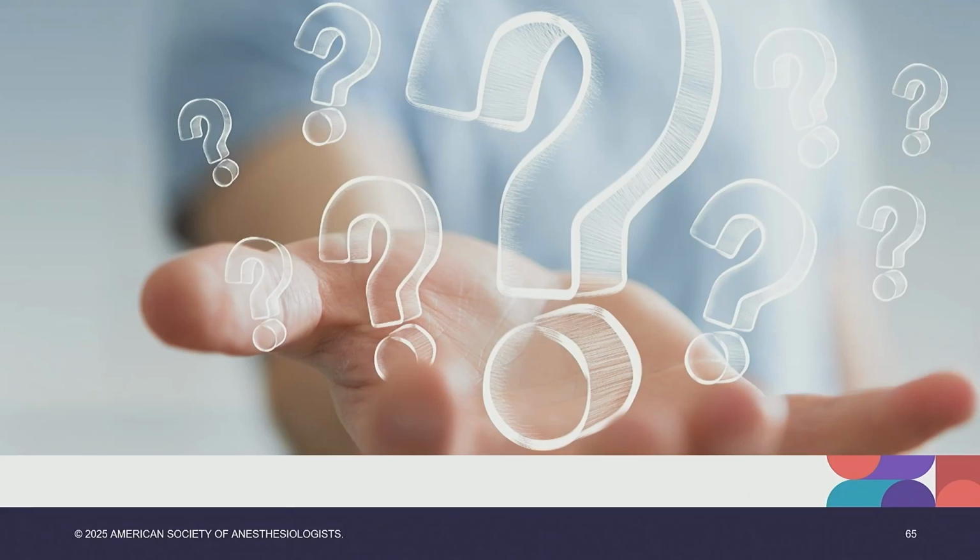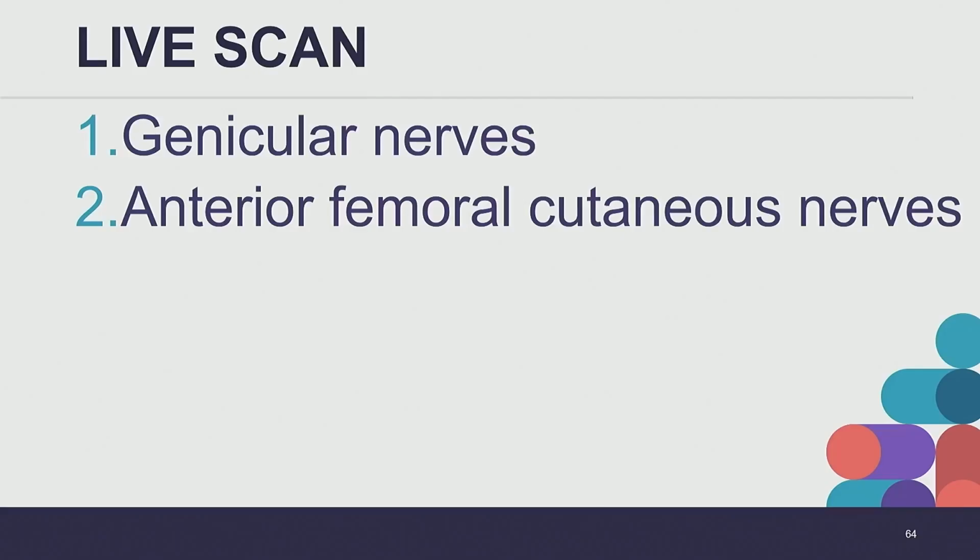Would you use a nerve stimulator for the nerve to vastus medialis? Yeah, and we typically do. The question is, do you typically use a nerve stimulator when approaching the nerve to vastus medialis for an adductor canal block? And the answer is yes, it does help. If you don't have access to one, I usually take that very lateral approach to get very lateral to that sartorius, just to really stay away from anything that resembles the nerve to vastus. And then as I'm traveling underneath the sartorius, start injecting and hydrodissecting that plane to really minimize the risk of mechanical nerve injury with a needle.